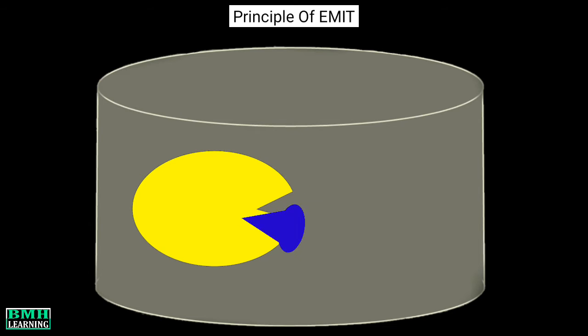After this, the substrate is released. Now the active site is empty. So that means another substrate molecule can bind at this position. In a similar manner, again the enzyme causes the substrate to undergo a color change. And then the substrate molecule is released to clear the active site, so that the next substrate molecule can interact with the active site and follows the same fate.